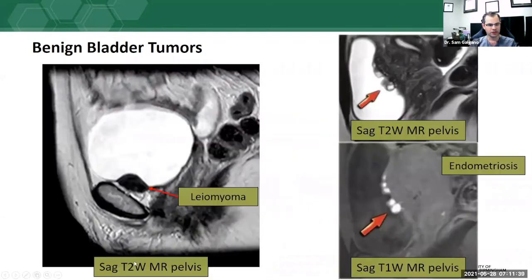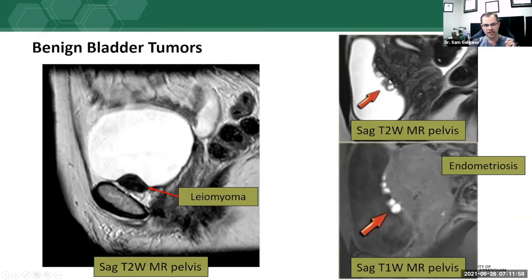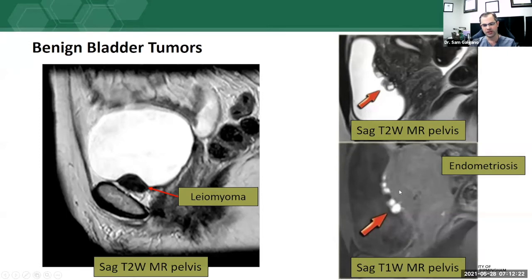On a sagittal T2-weighted MRI of the pelvis, a very smooth, well-circumscribed T2 hypointense lesion arising from the muscular layer of the bladder wall was biopsied and proven to be a leiomyoma — a benign bladder tumor. For bladder endometriosis, on a sagittal T2-weighted image paired with a T1-weighted image, blood products typical of endometriosis appear bright on T1. Multiple T1-bright lesions along the posterior surface of the bladder in a patient with biopsy-proven endometriosis show this characteristic T1 brightness.